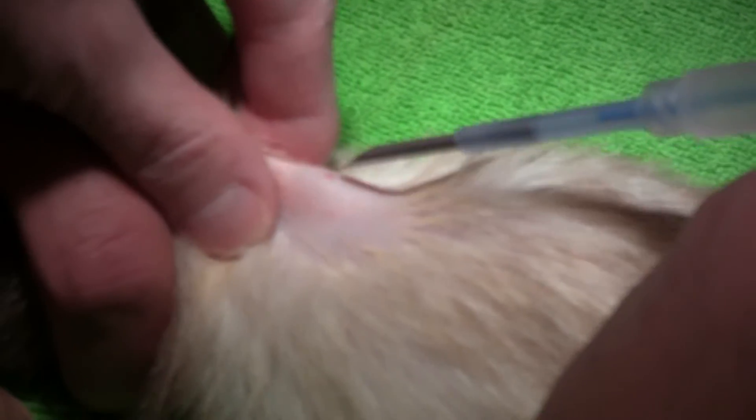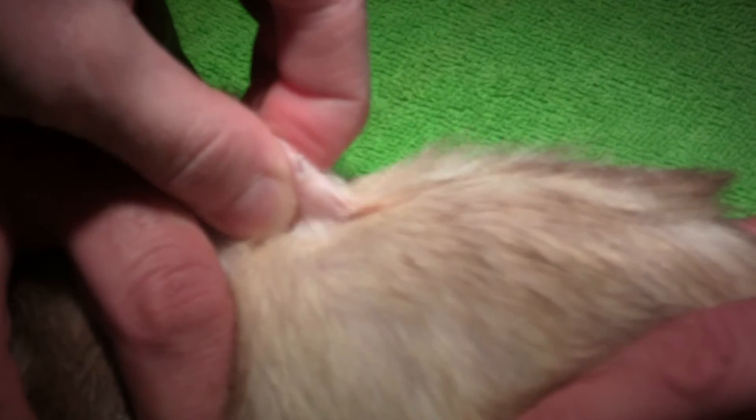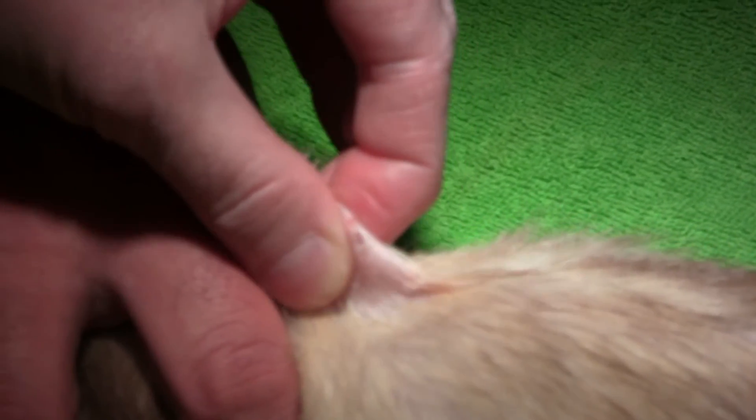I usually push the implant up until I can just barely see it. I try to go somewhat parallel to their body. So I go in my little shave spot here — pinch it.